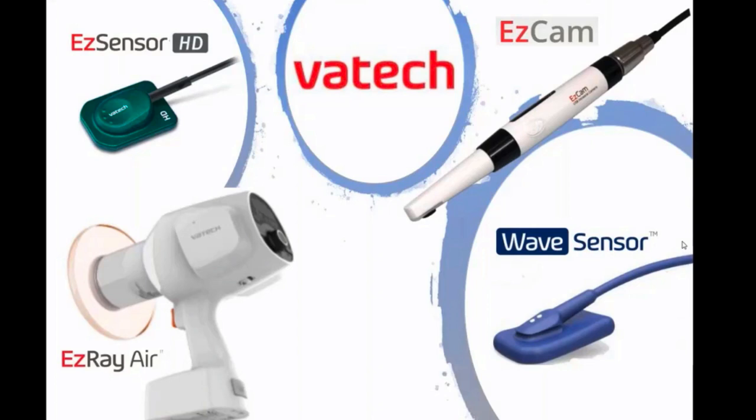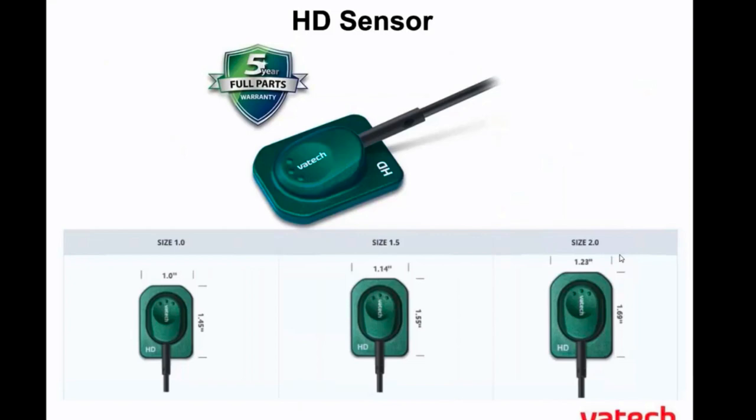We have a lot of different small equipment. We have the HD sensor, we have our wave sensor, we have our easy cam intraoral camera, and we also have our easy ray air handheld x-ray. Most of these are going to be part of our conversation today, and more than likely if you are using your Easy Dent I software, you do have one of these devices.